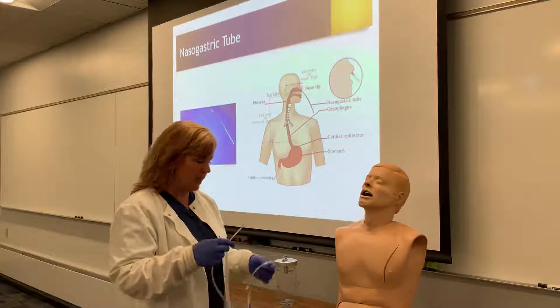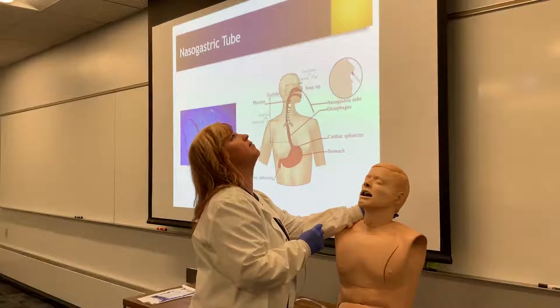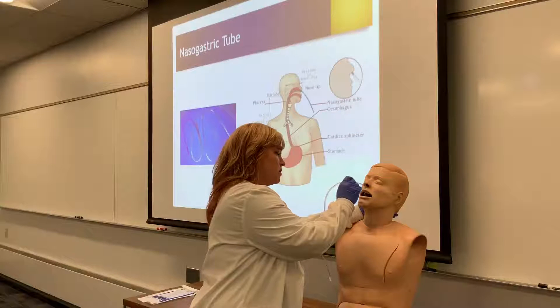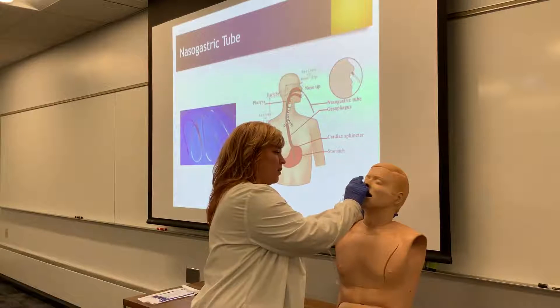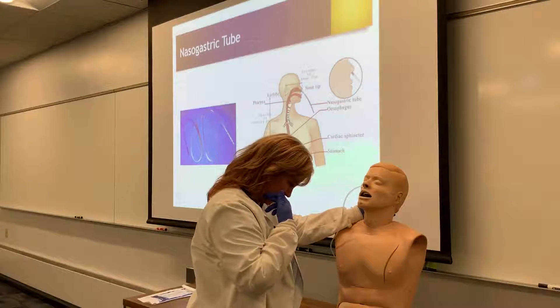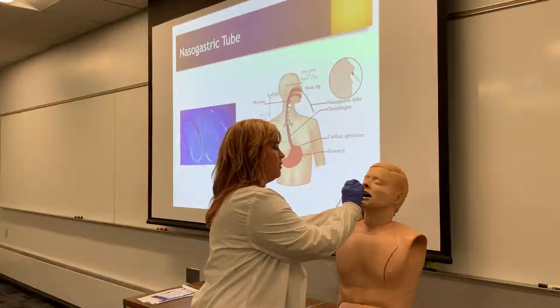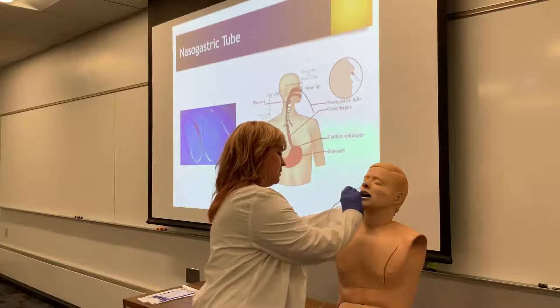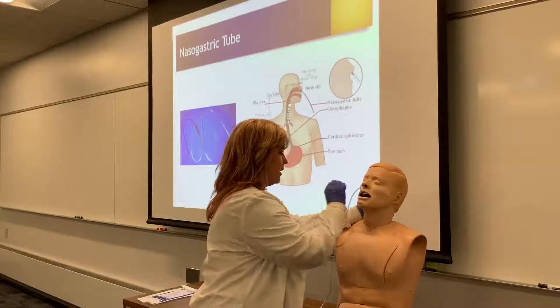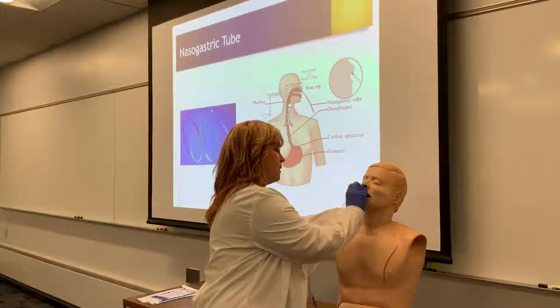Once I've lubricated the tube, I'm going to put my hand behind the patient's neck and have them extend. As I begin to insert, I'm going to ask them to swallow once I hit the back of the throat, and at that point I would have them bring their head forward. I'm going to continue to ask them to swallow as I gently insert, making sure I look at their mouth to ensure it's not coiling and coming out. I continue to insert until I get to my tape.